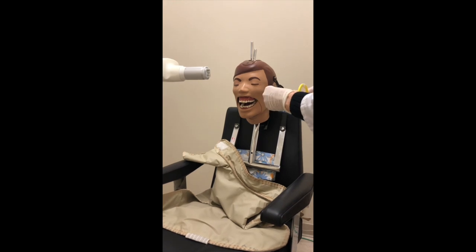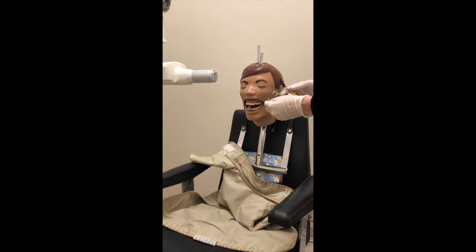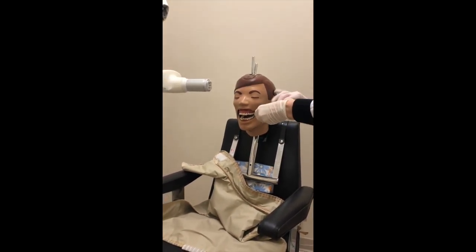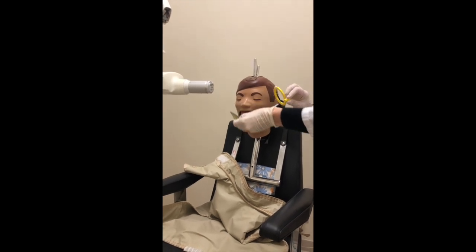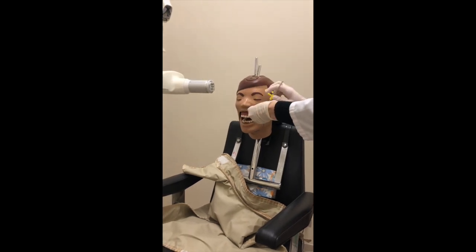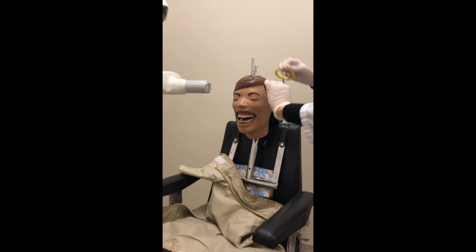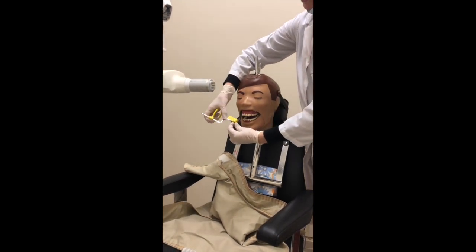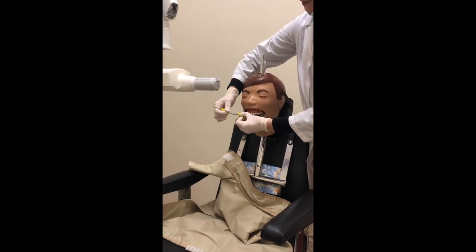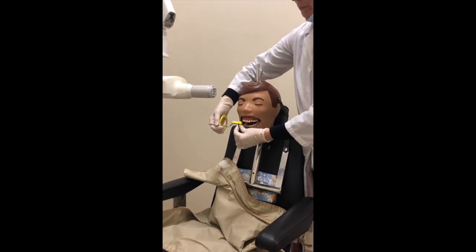Now I'll go over how to take for the second quadrant and the fourth quadrant. I'm just moving the arm over and of course moving the aiming ring so that I can see the film through it. Now this would be ready for the second quadrant. As well as the fourth quadrant — I would have to move this arm this way to allow for the fourth quadrant being in the mandible.